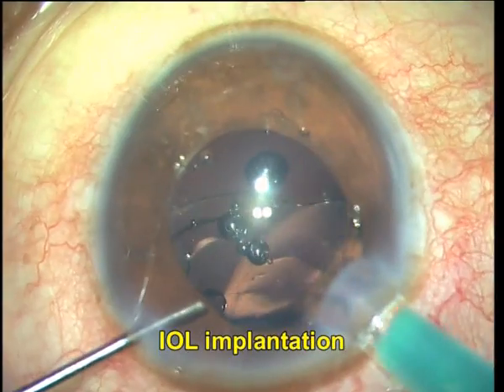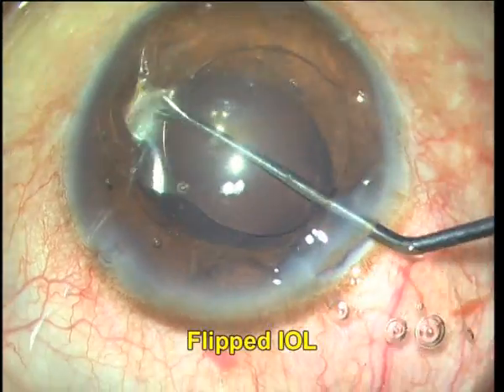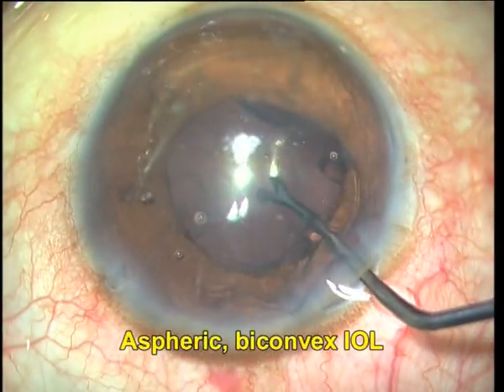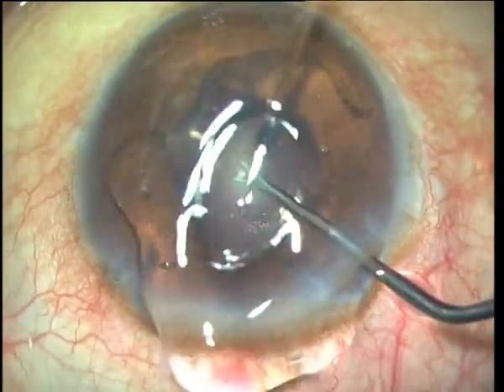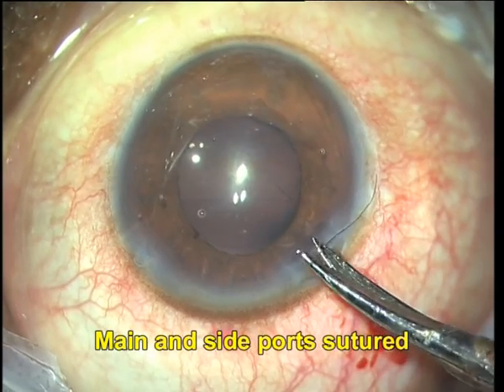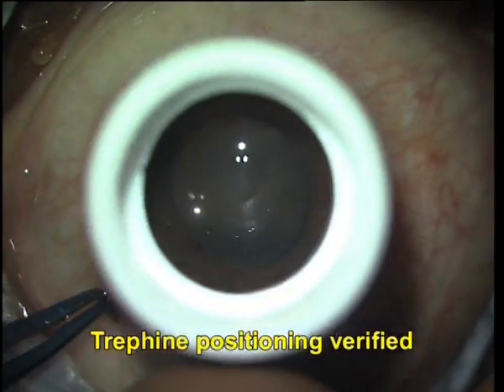I next implant the intraocular lens, but during implantation you can see that the IOL has flipped. However, since it's an aspheric biconvex IOL, I go ahead and do not try to re-invert it but instead implant it the way it has turned over. I now suture both the main and side ports as I want a taut anterior chamber, and I place the trephine and verify its positioning.